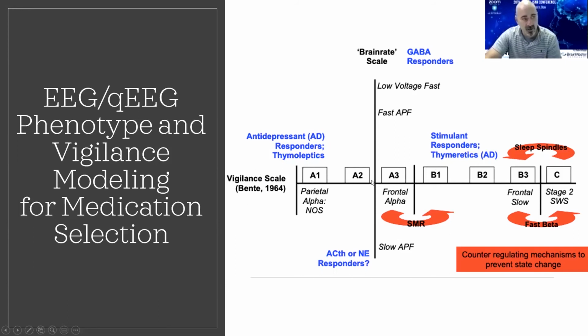And as we cruise along here, there's this vertical line down here with a slow alpha peak frequency. These folks are going to respond to acetylcholine or norepinephrine, generally like an Adderall type responder. And some of these folks really are incredibly hyperactive. It's really counterintuitive that you would see somebody bouncing like a cat on a hot tin roof, and then look at it and see that their alpha peak frequency is barely above 8 hertz. But when they're given appropriate medication, this will bring them back towards this line where they can in fact progress fluidly or with physiological regulation in both directions.